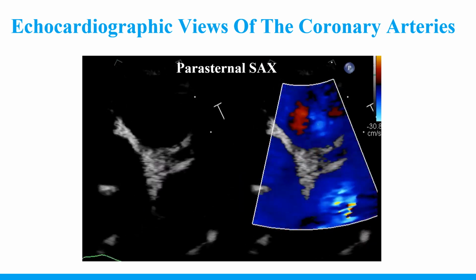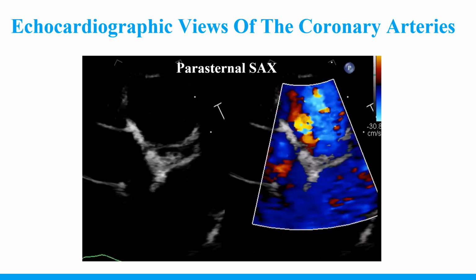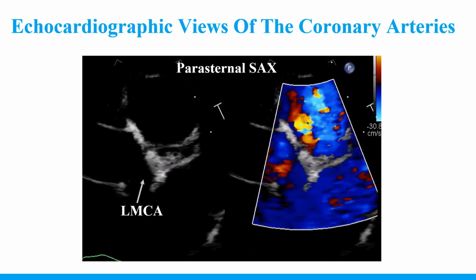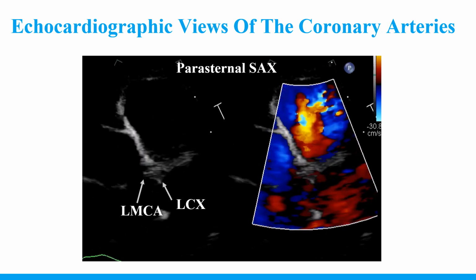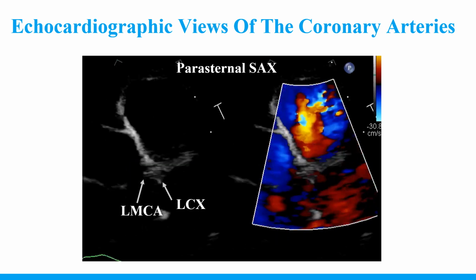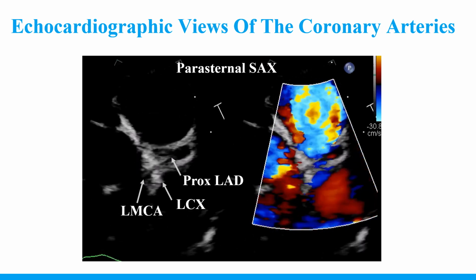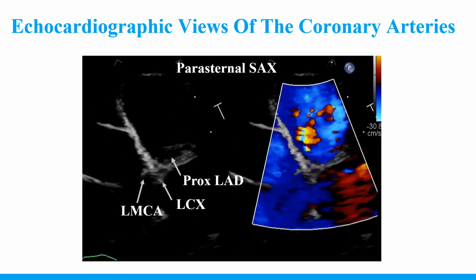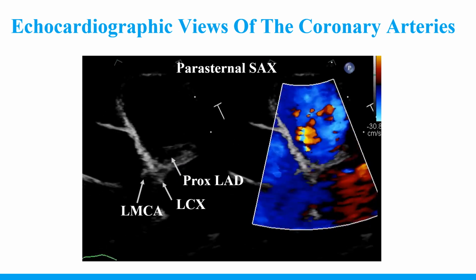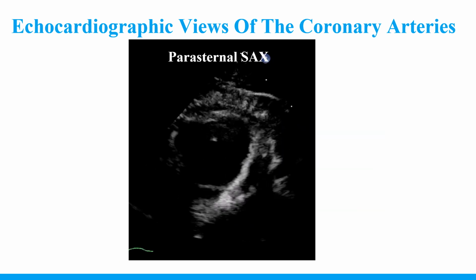So you'll see the left main, the LAD, and the circ. And you fill that with color. So you see that the left main, the circ that dives posteriorly into the left AV groove. Make sure you don't confuse that with any of the marginals that would go anteriorly, and then the proximal LAD. And you actually see that the proximal LAD is proximal to that pulmonary valve.